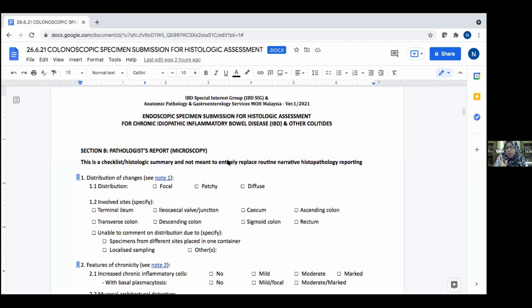You can make out the shapes of the neutrophils with cytoplasm and the multilobated nuclei. But in apoptotic crypt abscess or apoptotic bodies, it's just very intense dots of degenerated nuclei with intense eosinophilic cytoplasmic remnants, if you like. You don't see a nice formation of neutrophils as in the crypt abscess.